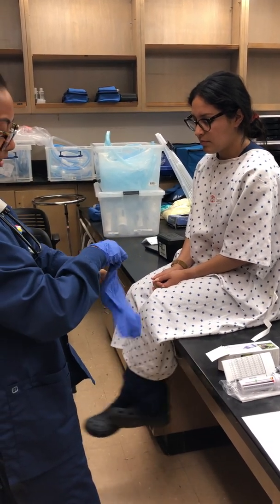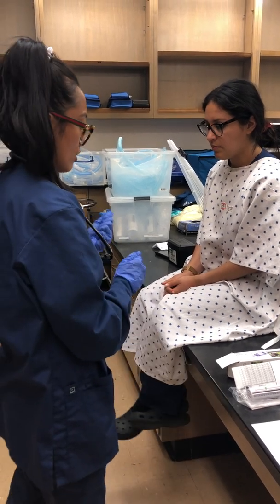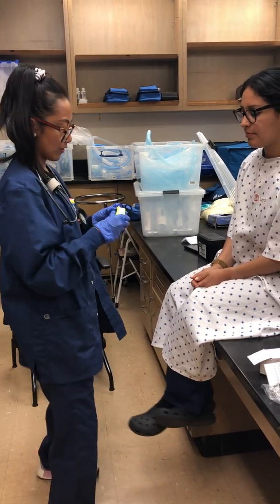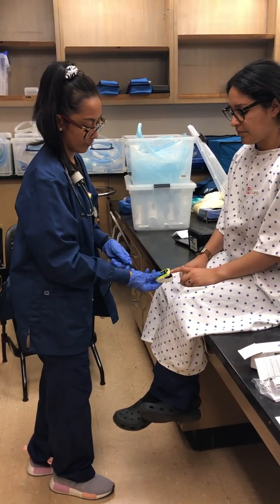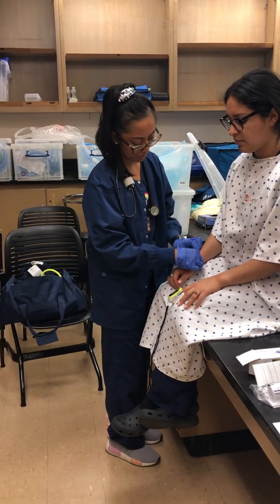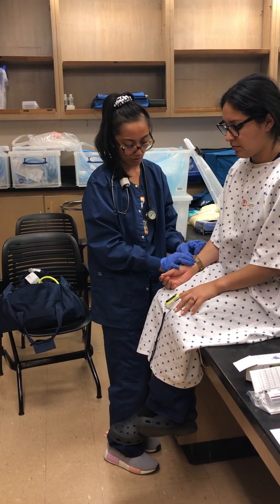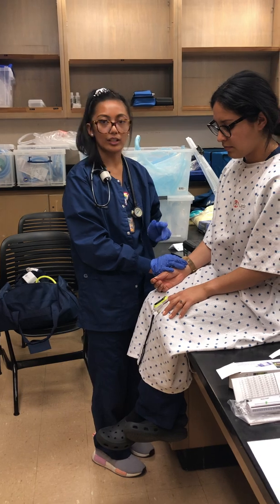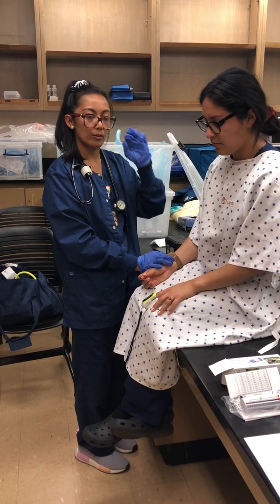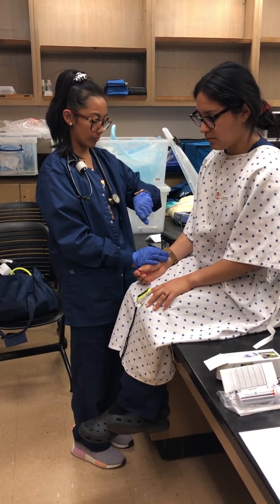So we're going to start with vitals. I'm going to take your pulse, your respiratory rate, and then your O2 saturation, okay? So I'll start by placing the pulse ox onto your finger, making sure that it's on. Okay, I'll check your pulse. I'm going to move your watch a little bit. And I would do this for 30 seconds for the pulse, and then 30 seconds for the respiration rate. But when I do the respiration rate, I would not let the patient know, just so that they don't change their breathing.